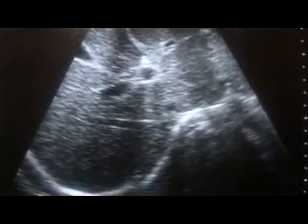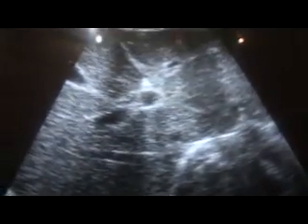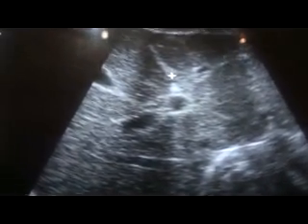This video segment is for the orientation of two linear structures that are seen when you are scanning in transverse section, especially the left lobe of the liver. One is this one. This is the linear structure, and second this one. Two linear structures in one plane. In one scanning plane, we are seeing two linear structures.